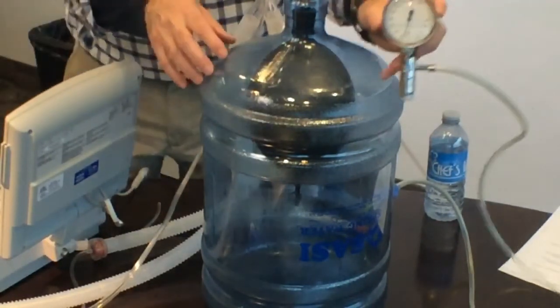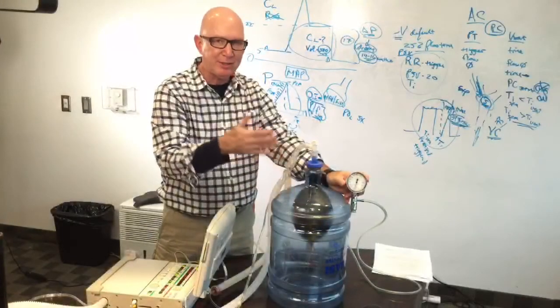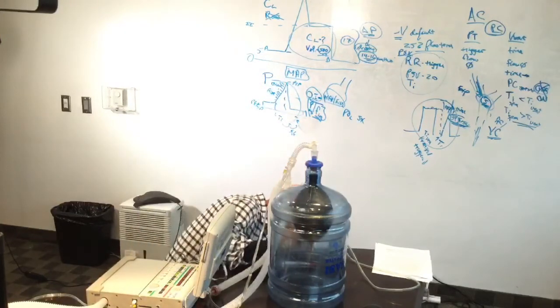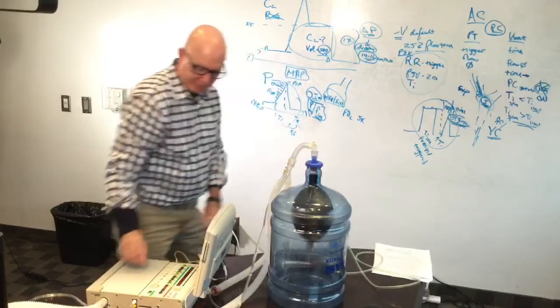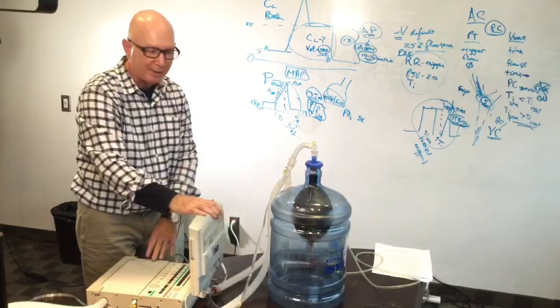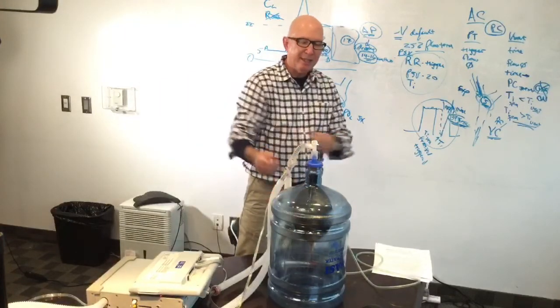So the point again is that excessive pleural pressures without adequate PEEP can result in difficulty in generating a reasonable tidal volume to your patient. And you might ask then, well, I don't have the luxury of an esophageal probe in transport, and correct, it's not done in every critical care unit either.